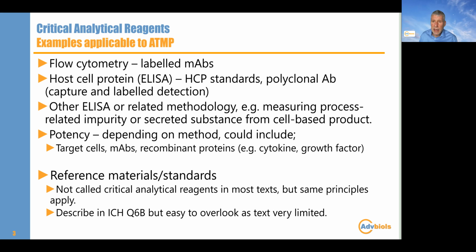So where you tend to see any advice at all tends to be in guidances that you might not look at, because they tend to relate to clinical and non-clinical. In particular, anti-drug antibody, so immunogenicity assays. This comes up quite a lot because those are quite difficult to control sometimes. And anything that mentions ligand binding assays, which also tends to be more directed towards non-clinical and clinical stuff. So it maybe is a little bit of a gap from the regulators, but hopefully I'll fill you in.